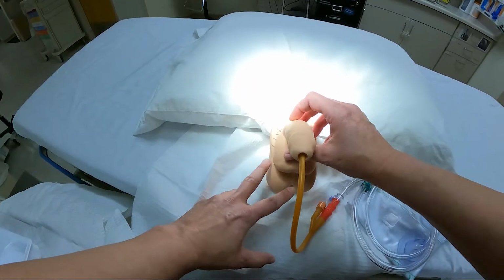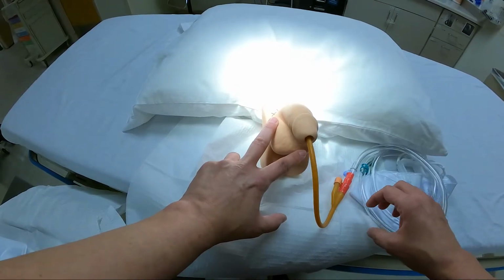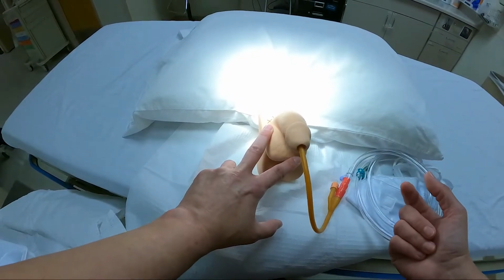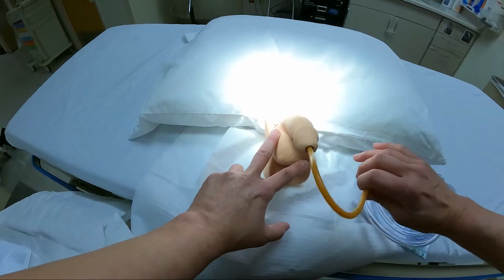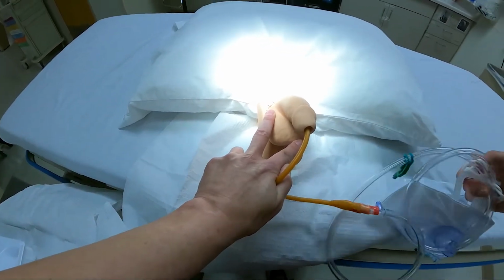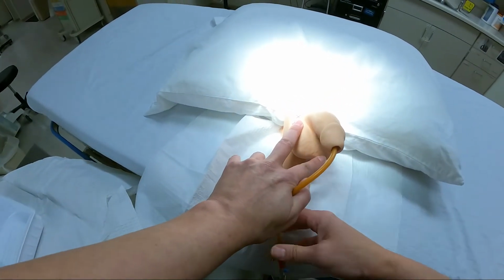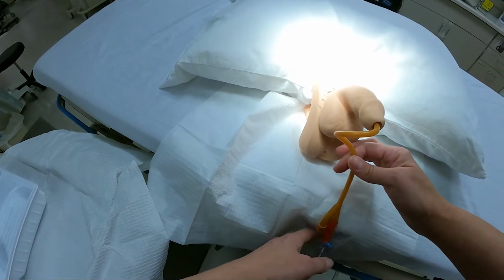Now, for men, it doesn't matter. You're still going to use a StatLock. Sometimes they have a preference, sometimes they don't. You want the catheter, again, not to be all bunched up, not to be sitting anywhere where it can collect drainage. So put it to the side of the bed. Same principle as with the female.